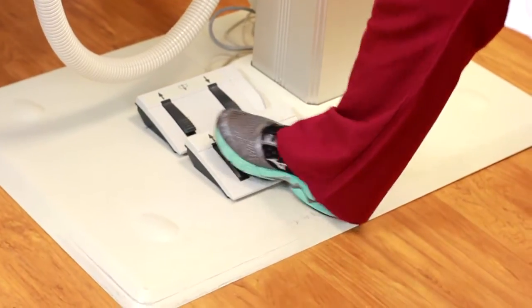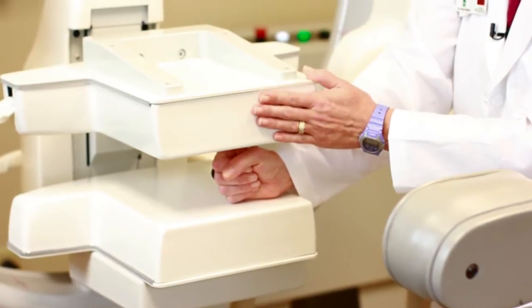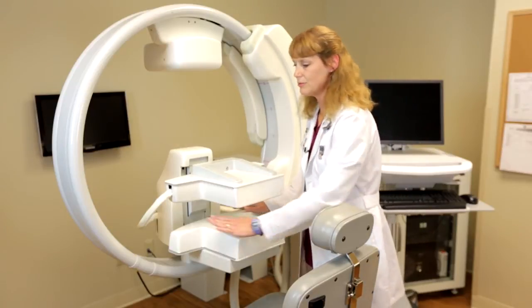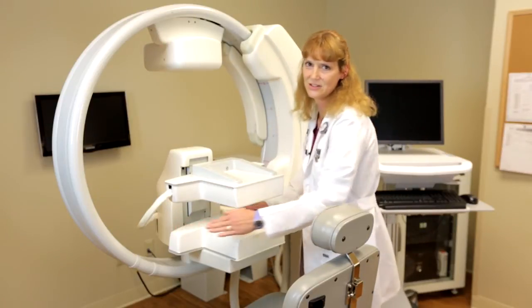With the foot pedal, we would bring the upper detector down to give them mild compression to hold the breast in place. Once we have the compression in place, the patient is then able to rest their arms on the sides of the detector for comfort.